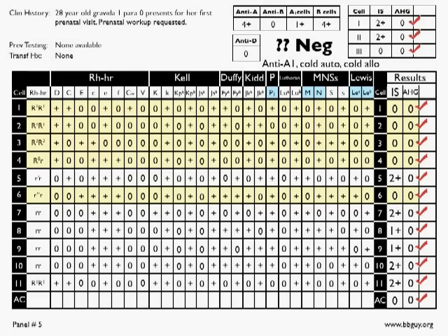And those five, you see them here. They're Lewis A, Lewis B, M, N, and P. It's almost alphabetical. L-E, L-E, M, N, P. Okay, well, you get what I'm saying. So if you want, on an exam, you can focus on just those five. You can do your cross-offs just based on those. And in this case, if you did that, what you would see is that the one that you can't rule out is anti-M. More on that in just a second.